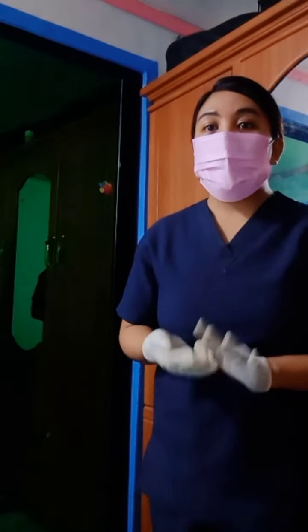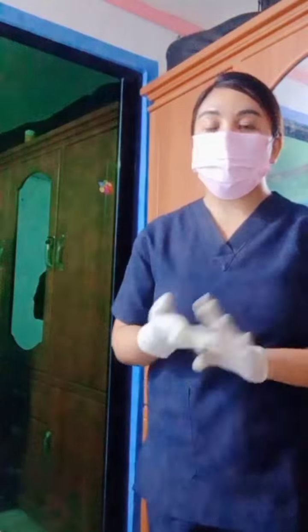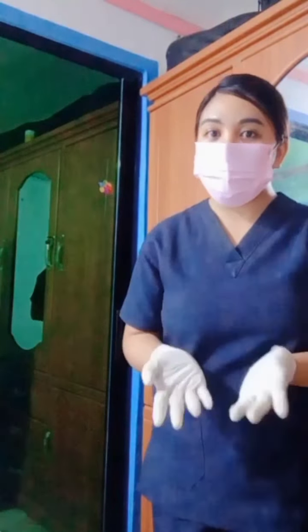Open the water-soluble lubricant and squeeze into the open sterile catheter package. Be careful not to touch the package depending on your agency's policy. You'll now apply either a pair of sterile gloves or a sterile glove on your dominant hand and a clean glove on your non-dominant hand.